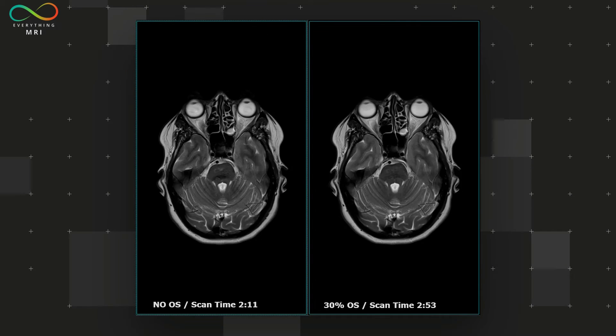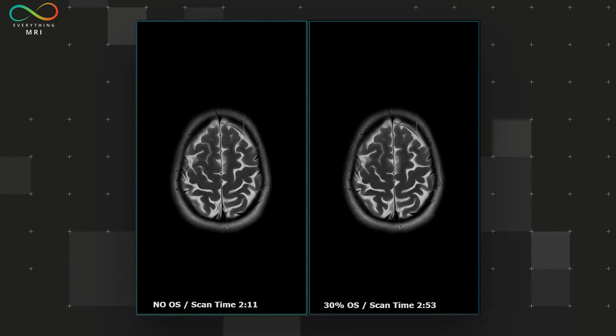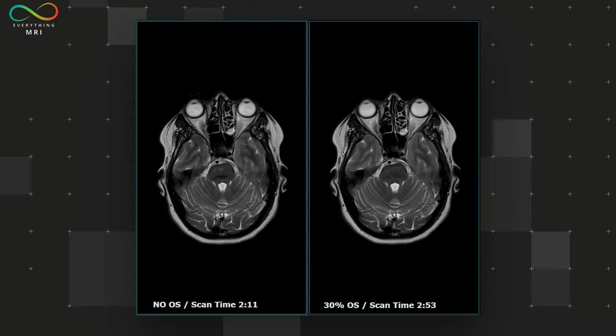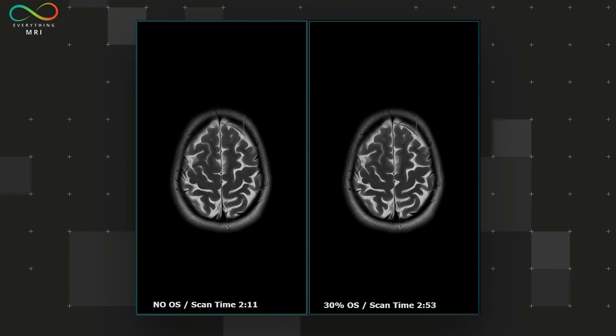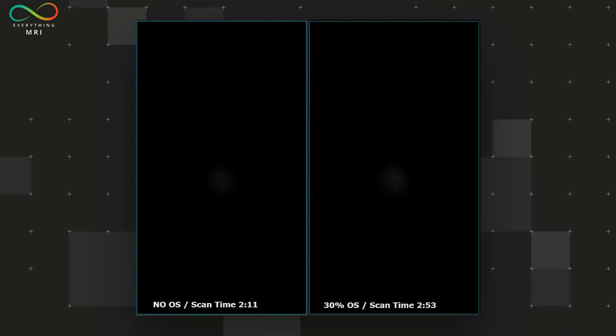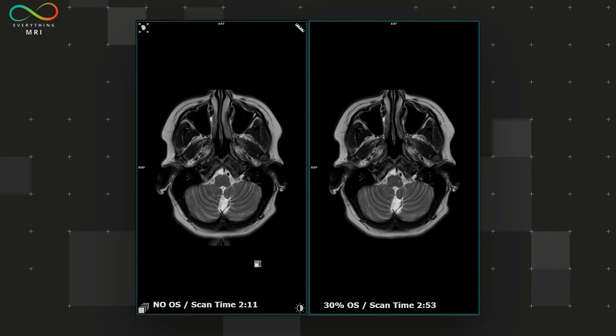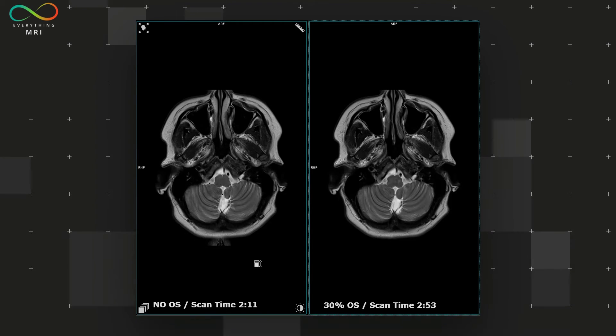Here we have two axial Turbo Spin Echo T2 images, both with a phase encoding direction AP. The one on the left lacks oversampling and thus has a shorter scan time, while the one on the right incorporates a small percentage of oversampling and therefore resulting in a longer scan time. So keen observers might have already noticed something I would find as peculiar probably. There you go, you might see it now.